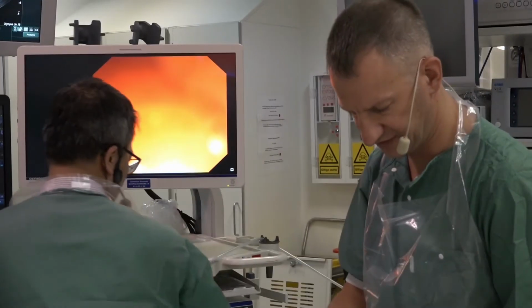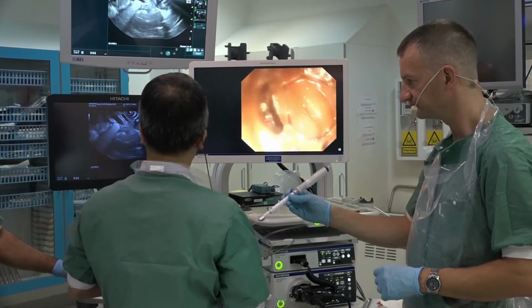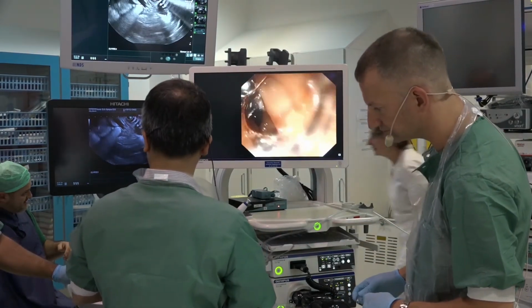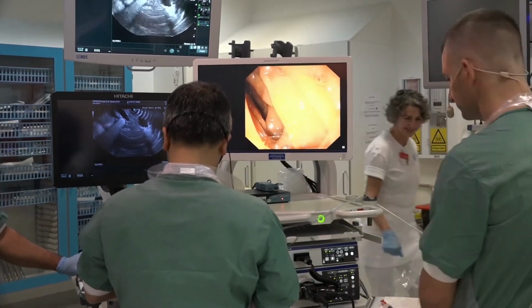So I'm locking everything now, putting it into the original position now. What orientation are you using? Thomas, can you tell us a bit about the orientation? What's your orientation in Bergen? Are you using the cranial, caudal, or left, right? I use also, I don't know how. In fact, the same orientation as I have now. Okay. So the instrumentation comes from the right side of the screen.